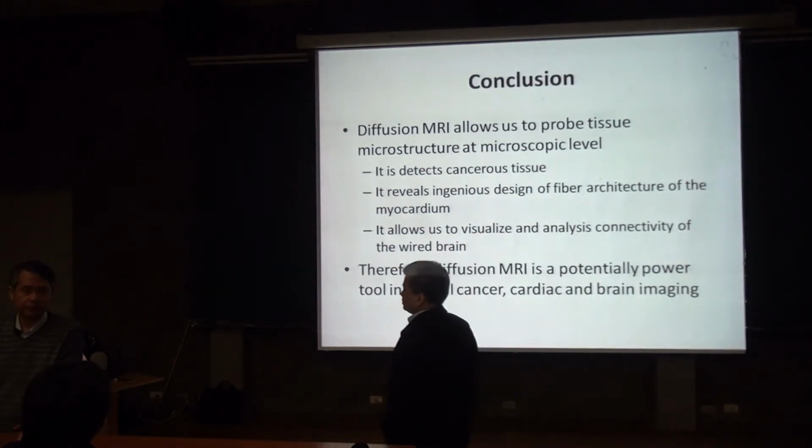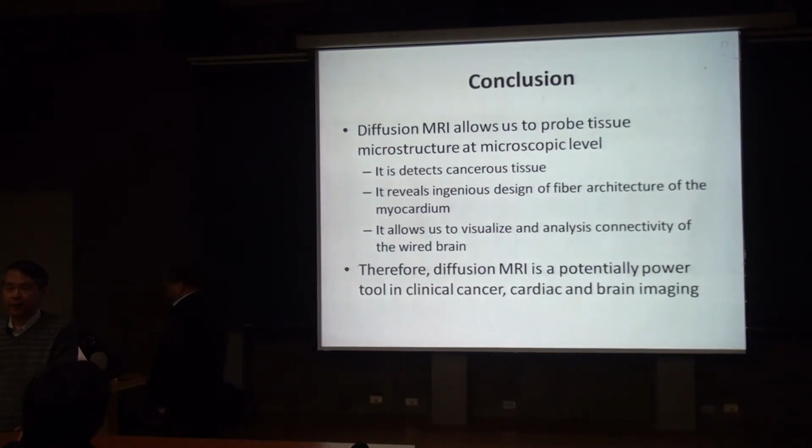I prefer the resolution to be 1.5 millimeters. I think at 1.5 millimeter cube, we will see smaller fibers.